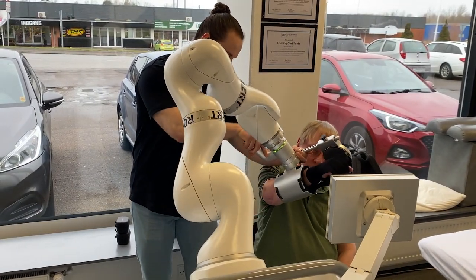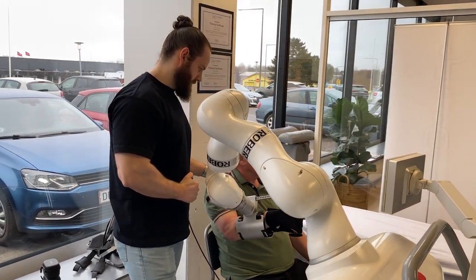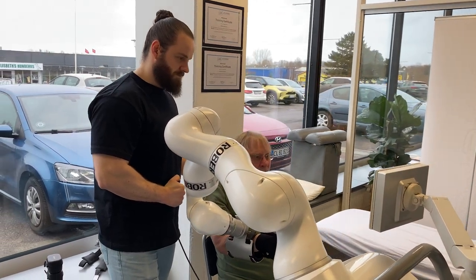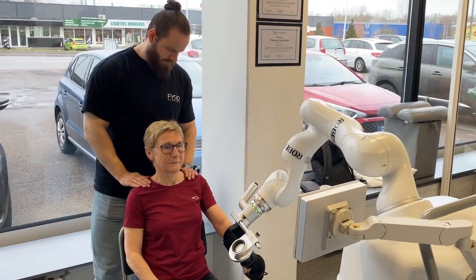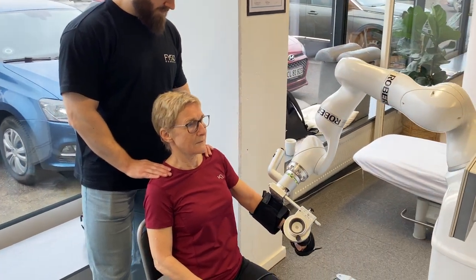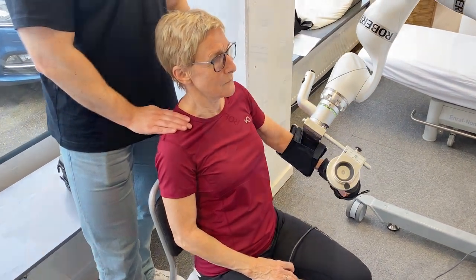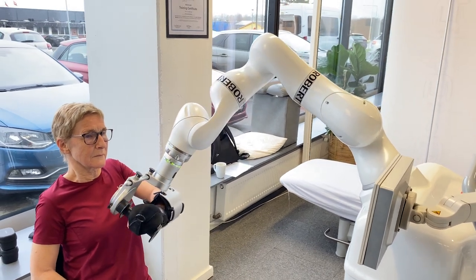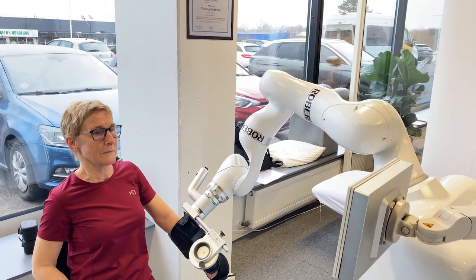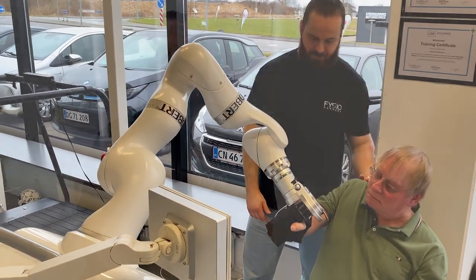What we want to restructure is our test-retest battery. When we take in new patients and existing patients, we're going to test them — go through the whole neurological test process and see exactly what they need to train, what's lacking: is it the arm, the leg, what muscles are not functioning, what functional movements will help them. We'll do a lot of tests, then start up the whole process with ROBERT, and do periodic retests to see how well they've been doing. If something's not working we'll change it, and if it's working we'll just keep going until there's no more progress.